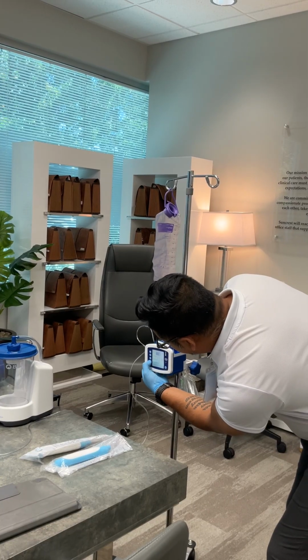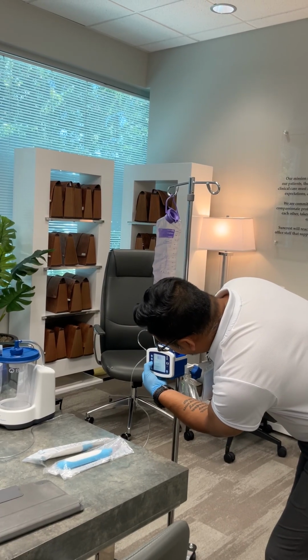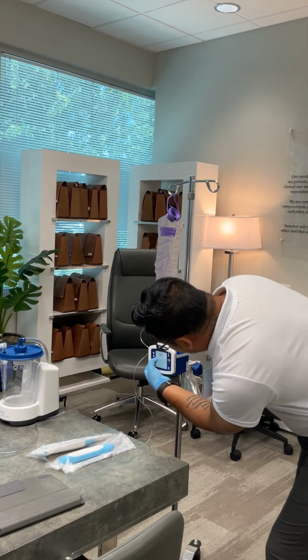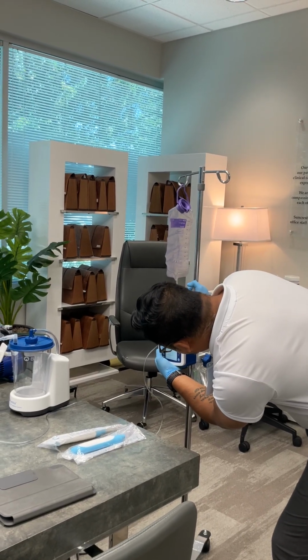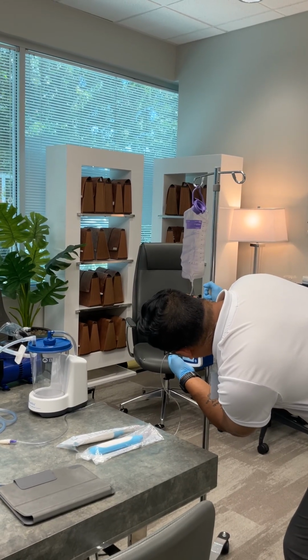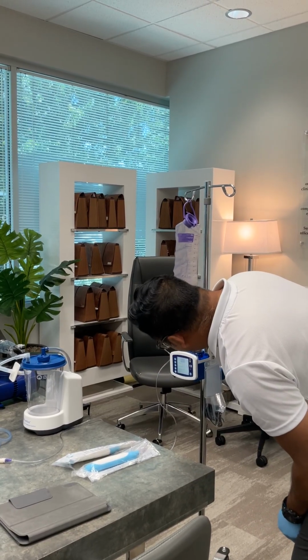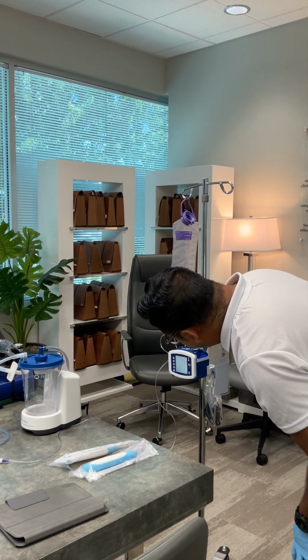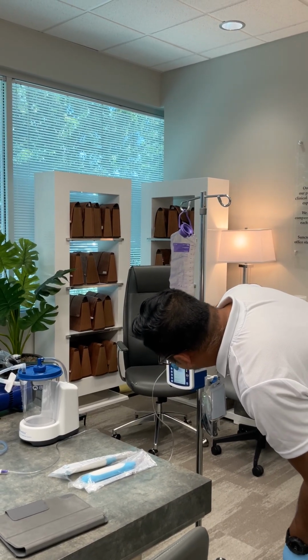If you want to adjust the ones place, you press the arrow that corresponds, and it'll go to the right and then up. So you can go 1 all the way to 9, and then it goes back to 0. And then the tens place, let's make it another 0, like that. And then the hundreds place, let's make that 800. Oh, actually, that only goes maximum 400, I'm sorry, because it's per hour. So maximum 400 on that one. And then once you're happy with that, you click enter, like that. And the total volume, you can also set that, and that's up to 3,000 milliliters max.